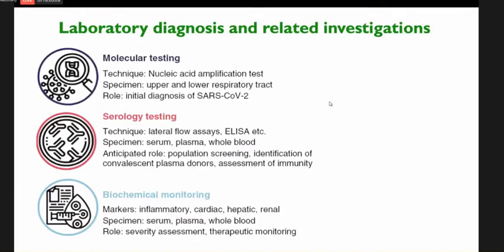It is now clear that the clinical laboratory plays a critical role in this global health crisis by contributing to patient screening or diagnosis, monitoring, and treatment, as well as by providing epidemiological surveillance. The laboratory investigation of COVID-19 includes diagnostic tests like molecular testing, serological testing, and tests related to biochemical monitoring.